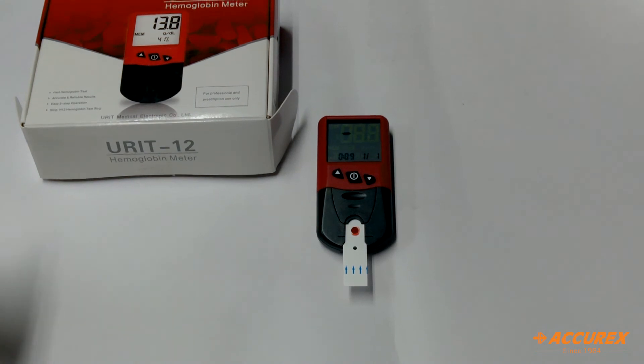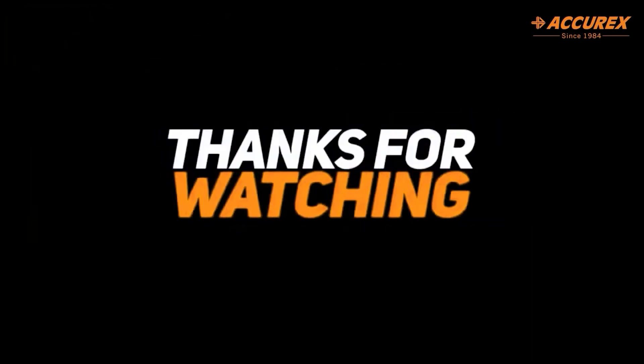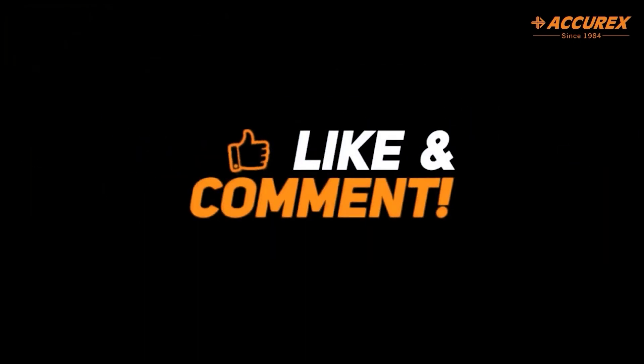In a few seconds it will show the results. Here we go.